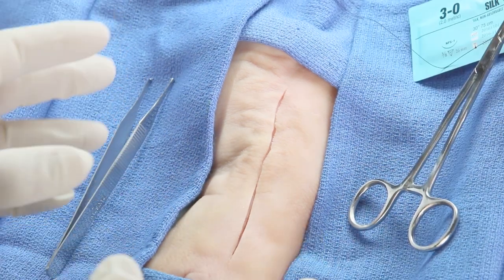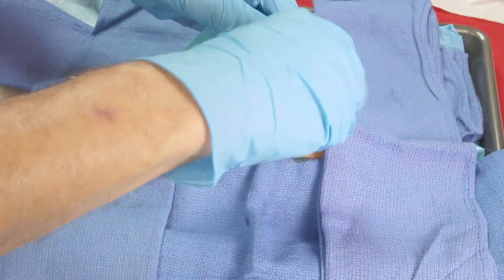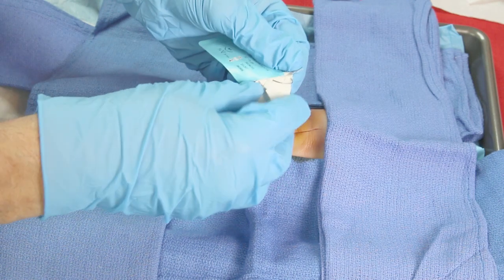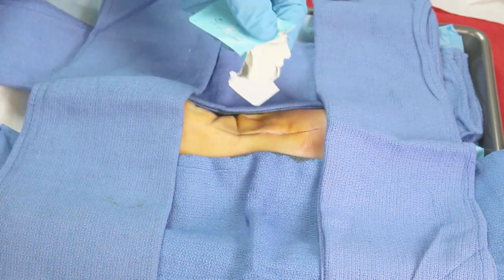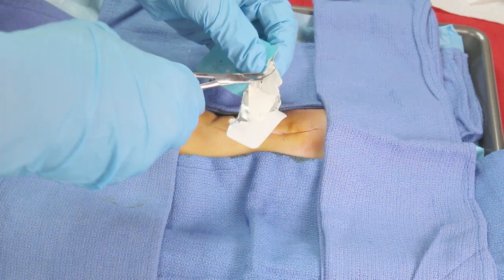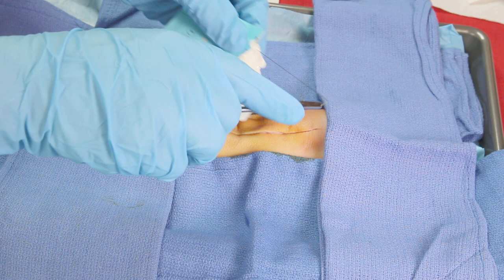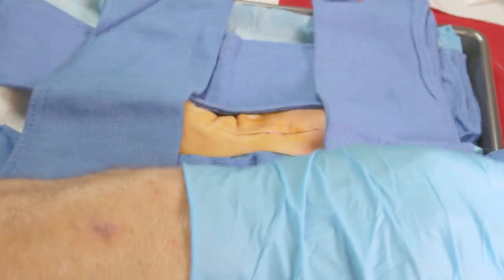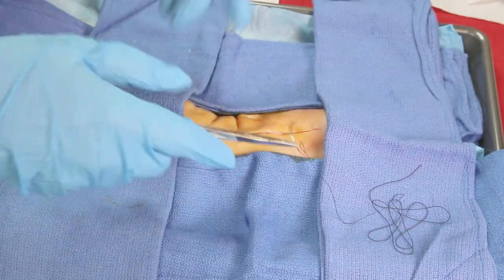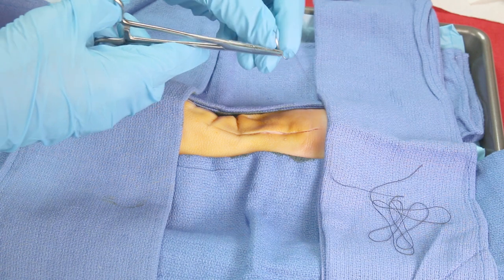Here's where we left off with Nurse Amy in previous videos. Now it's time to take the suture out of its package and load the needle. You'll open the package, use your needle holder to grasp the needle and pull it and the suture string out of the package. Don't let the string stray outside your sterile field. If you're right-handed, the sharp end of the needle will face left; if left-handed, it will face right. For most purposes, the pointy end should face the ceiling.